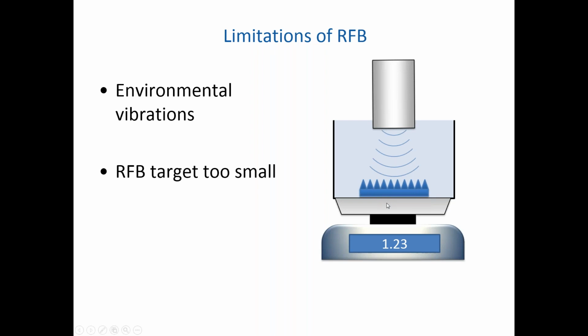We may also have a situation where our absorbing target is imperfect. And in this situation, we would get a reflection back towards the transducer. Certainly for some therapeutic transducers, they can be very sensitive to back pressure exerted on them. And so simply by the fact that there's a waveform reflected back to the transducer, this can impair the radiation output efficiency of the source device. So not only do we get an imperfect conversion of waveform that's going into the force that's exerted on the balance, but we're also impairing the output of the transducer.